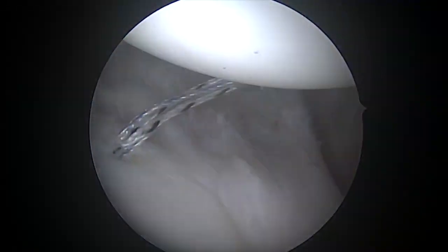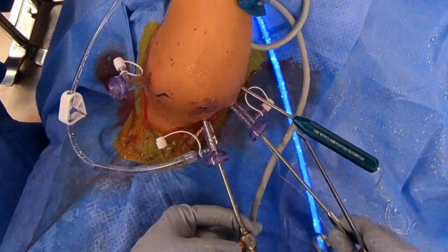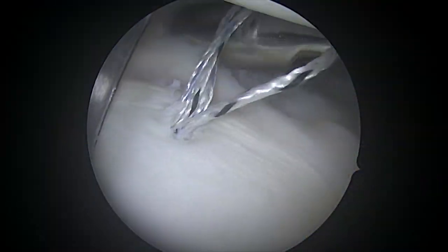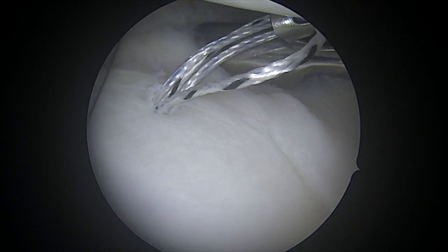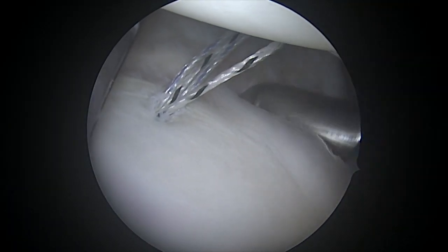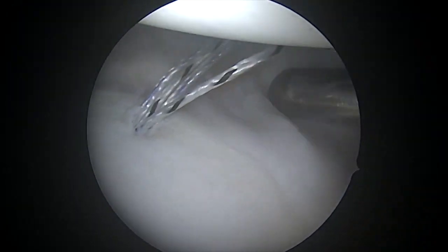Looking inside, we've already placed one anchor down at the very bottom. You can see how loose the ligaments are. The first thing we're going to do is bring in this instrument called a rasp. This instrument is used to roughen the capsule to encourage it to scar down to itself so that we can tighten the ligaments and allow them to be folded over and healed to each other.